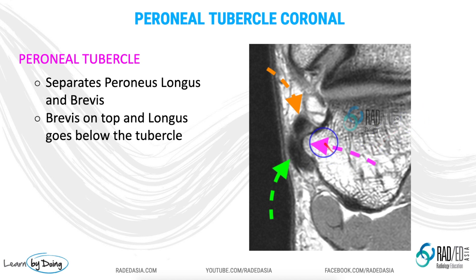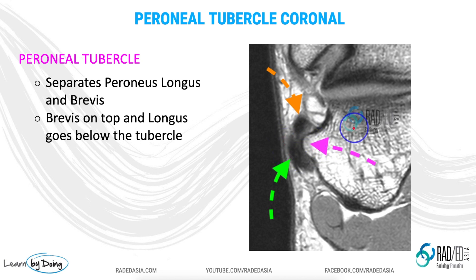The importance of this tubercle becomes apparent if it's enlarged, as the peroneus longus and brevis tendons move against it and can result in tendinosis, tenosynovitis, or tearing of these tendons. So an enlarged perineal tubercle is important to recognize and describe on MRI.